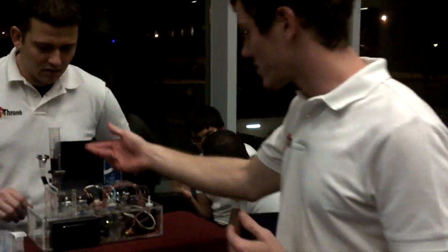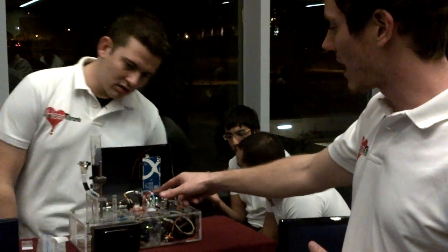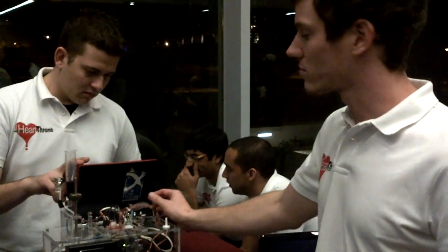So then, as you can see, the blood will start to flow through the tubes, through the chip, and then out through the exit tubes into the exit bag. And each one of these tubes represents a different artery in the heart.